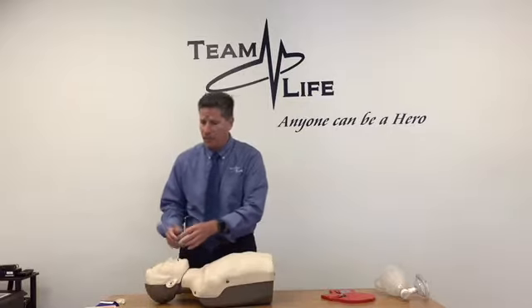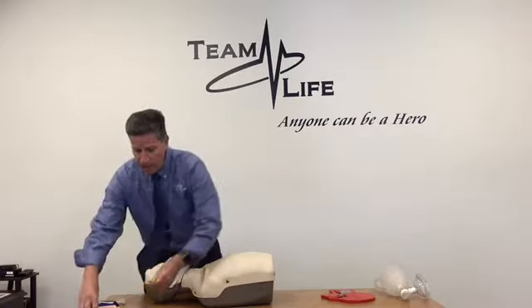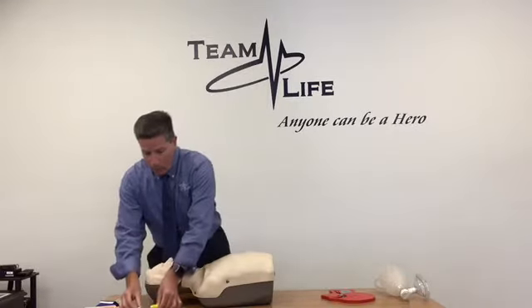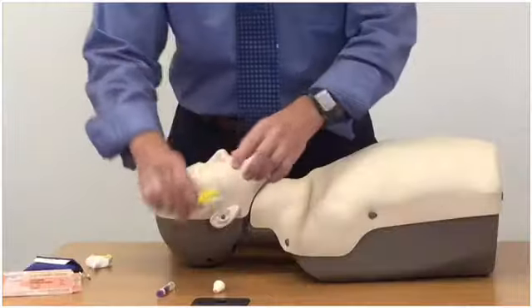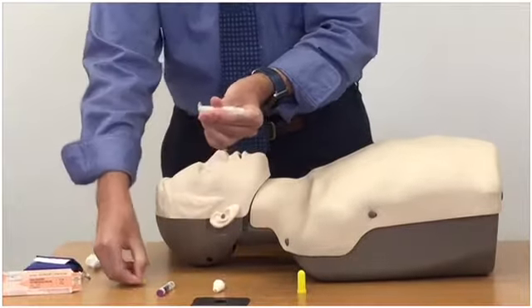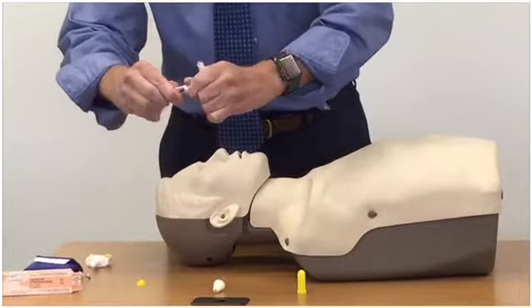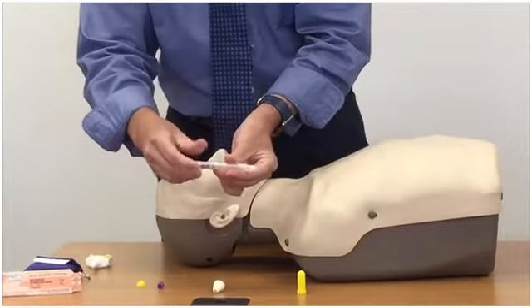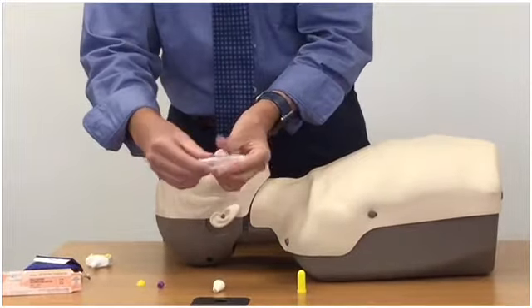Another popular device that's out there is in three different pieces that we need to quickly put together. What we're going to first do is take the syringe out. I'm going to take the two yellow caps off. The Narcan is in the ampule, which I'm going to take that cap off, and I'm simply going to screw the ampule into the syringe.